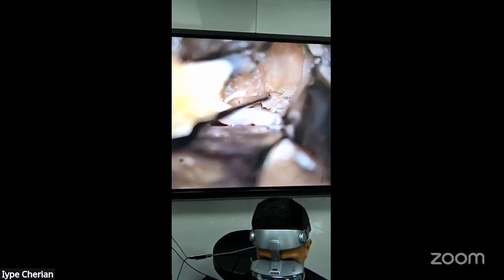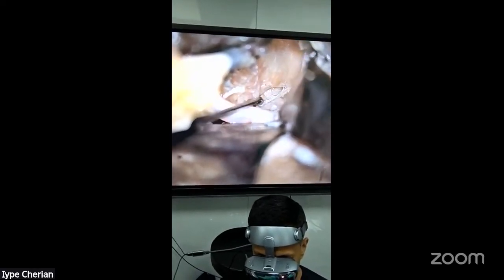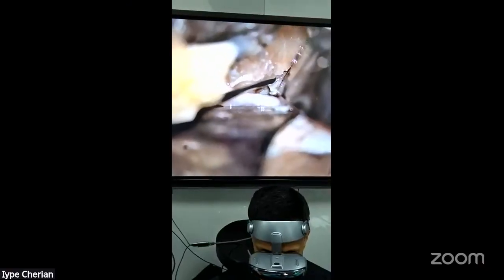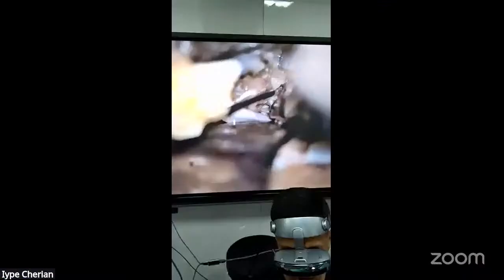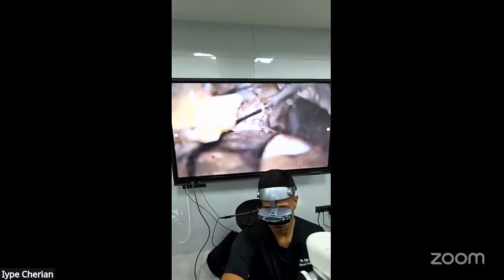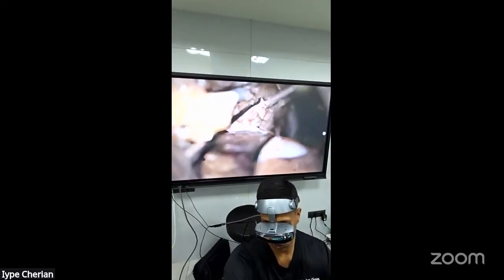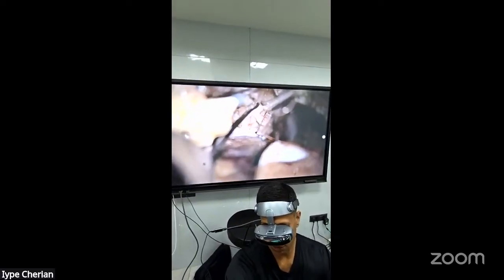Yes, sir. Give me another dissector. That is the fourth nerve. Can you have someone go to the wall to point it out? That's the fourth nerve. And wait, this is the V1. And we will show you the sixth nerve very soon. That's the C5 carotid.